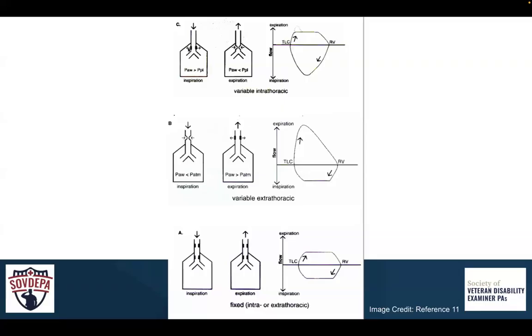So wherever the blockage is, closer to that blockage, it's going to be harder, less force, harder for that force of the small airways, or harder for the force of the air entering the mouth to move past that, versus if more distally, for this extrathoracic obstruction, you can build up more pressure to get the air out. That's how I think of it.